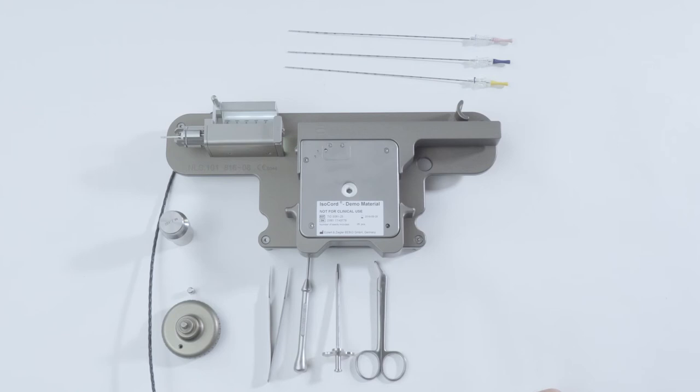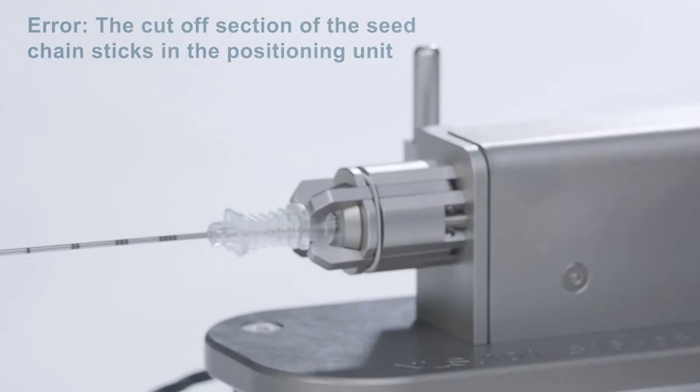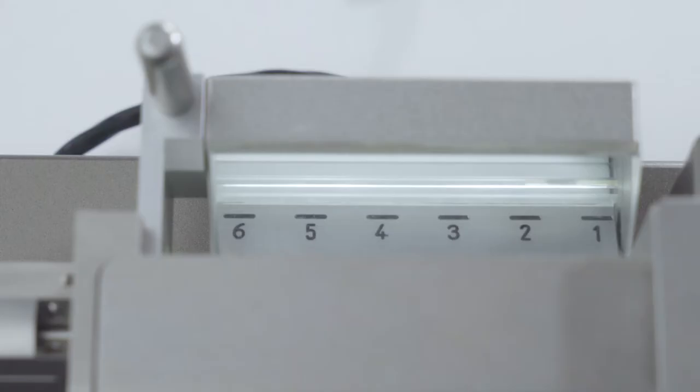Another possible problem: the cut-off section of the C-chain sticks in the positioning unit. A cut-off section of the C-chain cannot be moved towards the needle inside the guide system of the positioning unit using a stylet. The stuck section of the C-chain must be retracted and removed.